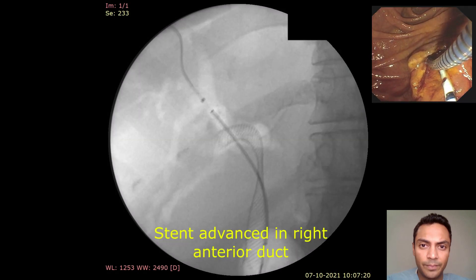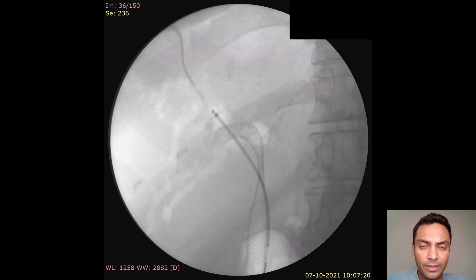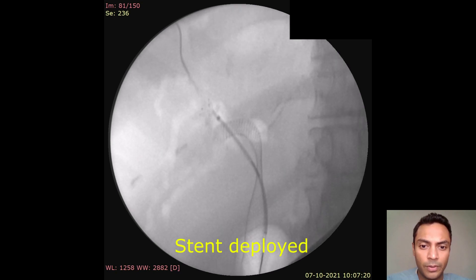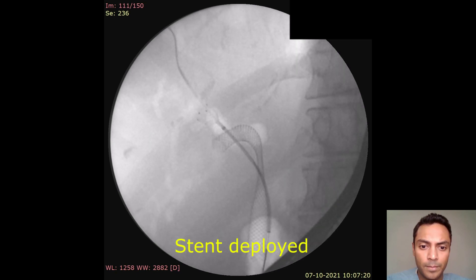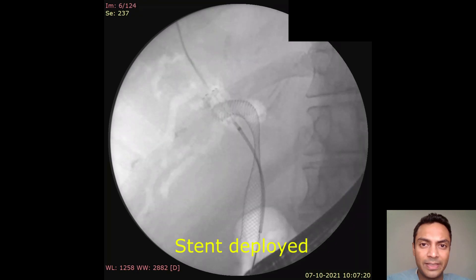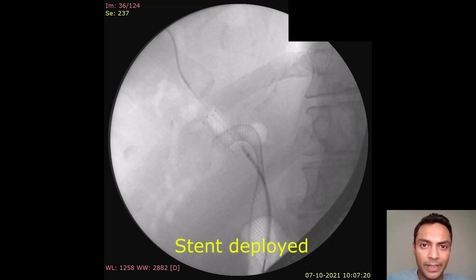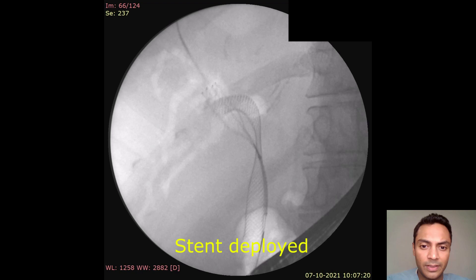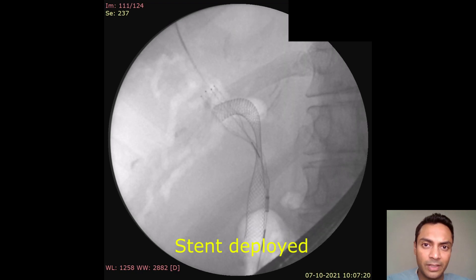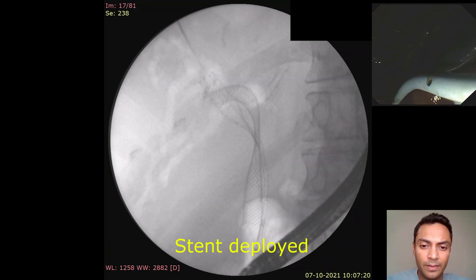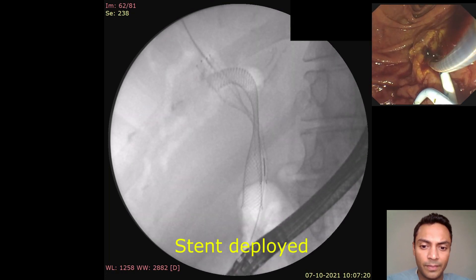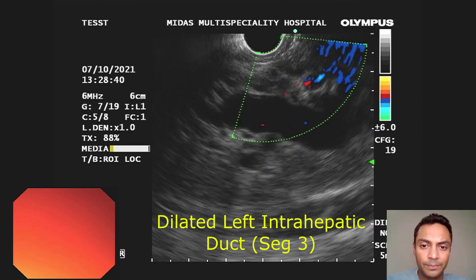Next, in the right anterior duct, we placed a Zilver stent by Cook. We usually like to place these stents at the end because once you place the first Zilver stent, you cannot put another stent after this. Here the stent is deployed inside the bile duct.